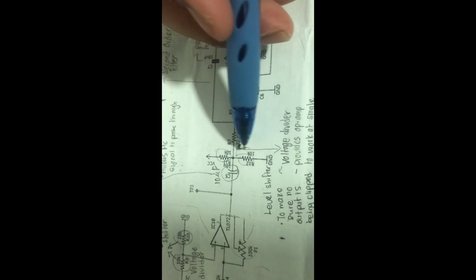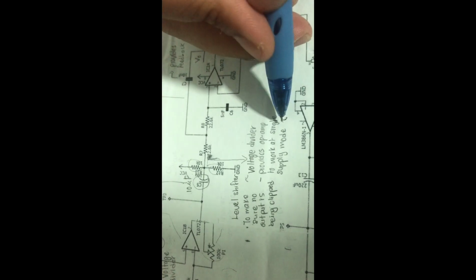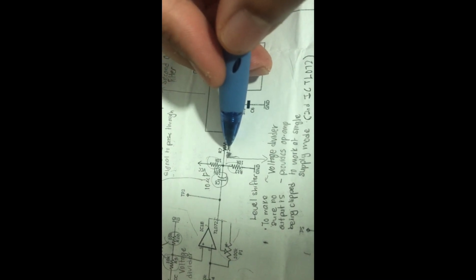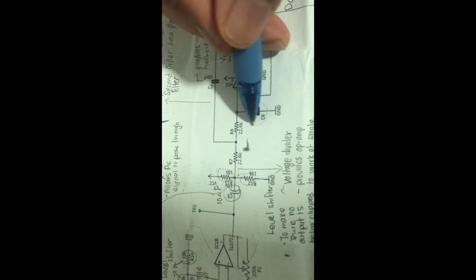So you can see here, this is a voltage divider. It divides voltage, and provides for the op-amp to work in single supply mode. This voltage divider is specifically for the second IC, which is the TL072. So here we have R7 and R8, 22.6k each. There's a wire going over here and coming here, and there's another wire going here and connecting to pin 2. Or else we can say that pin 2 is going all the way to pin 1, and pin 3 is connected to this ground and a 5nF capacitor, which is connected to here. This is also at pin 3.